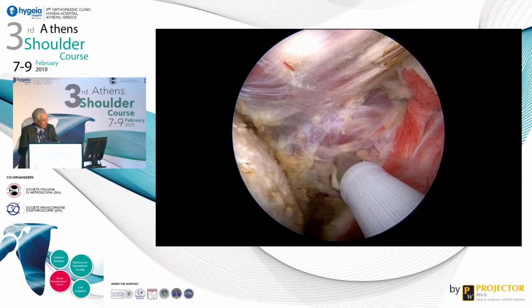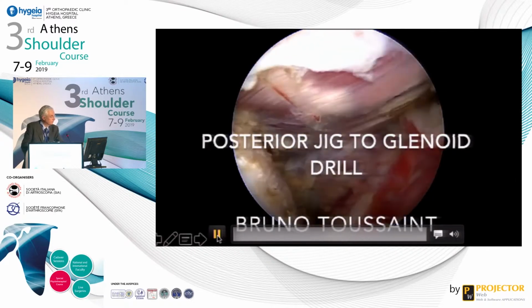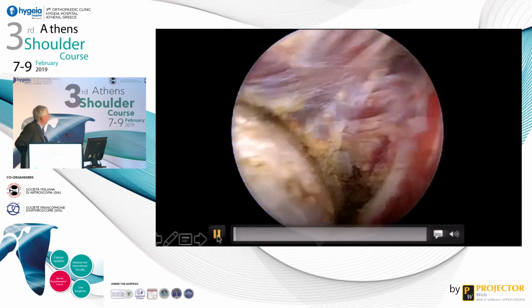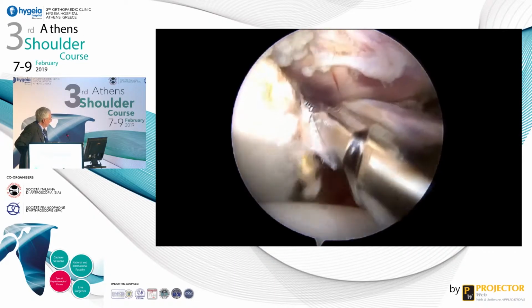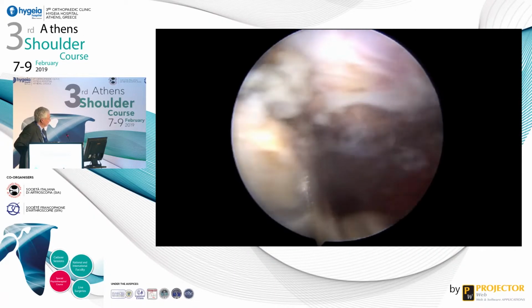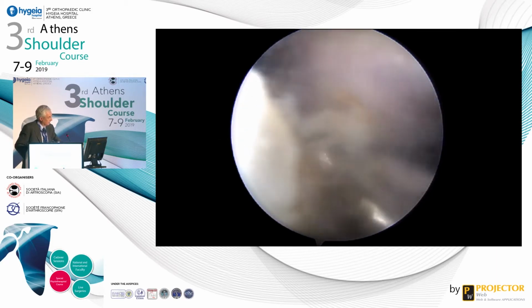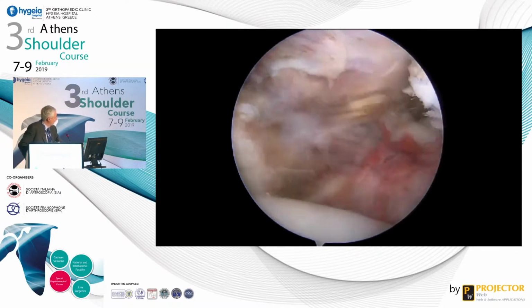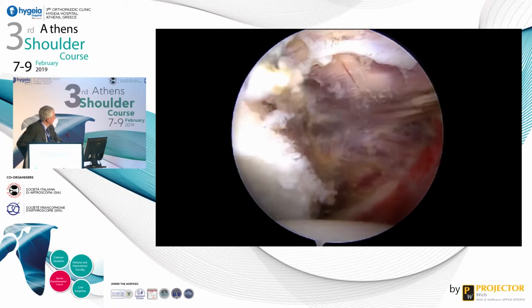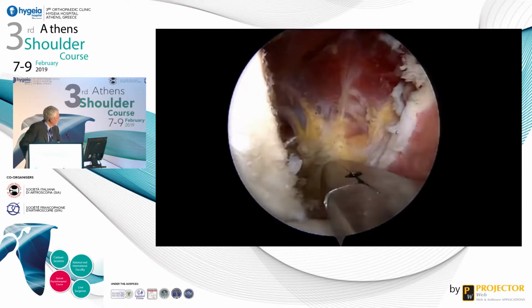And I use a posterior jig to create the two tunnels. I use a power rasp to prepare the glenoid surface, because I mean it's definitively easier and you don't make any wave over the glenoid surface to have the best contact as possible.